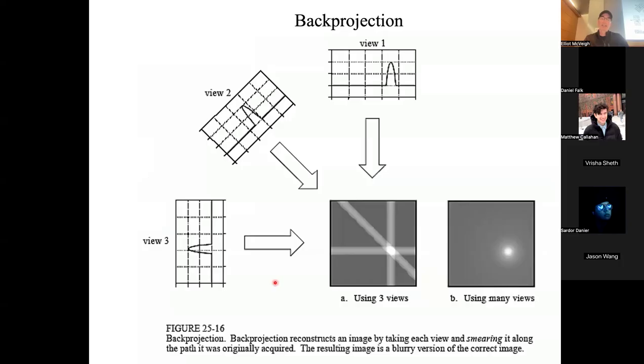And if you do that, not just for a 3x3, but for a large, say 256 squared, and you take 256 projections, such that each projection produces, if this is our profile, I'll give away the answer that the object is a disk here.